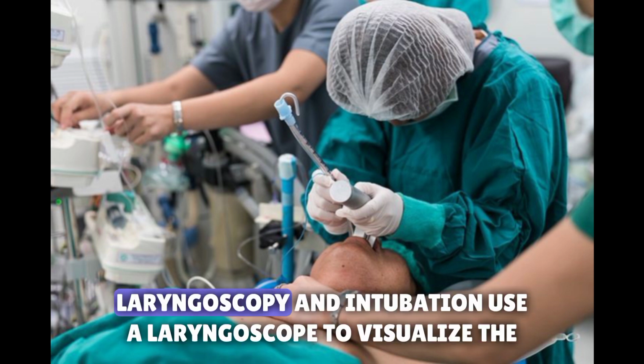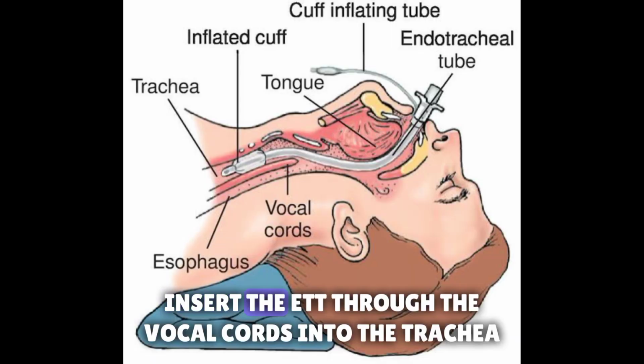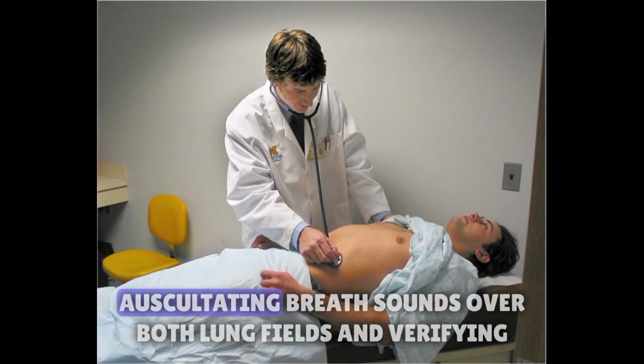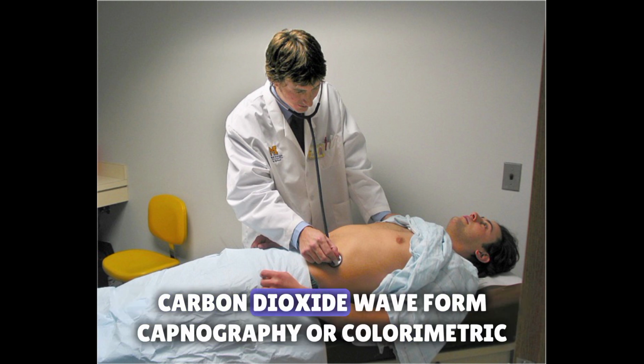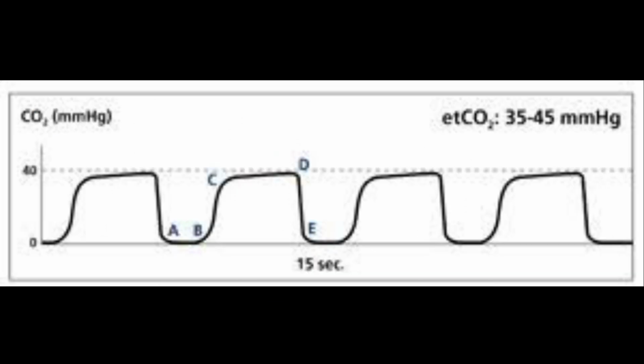3. Laryngoscopy and intubation. Use a laryngoscope to visualize the vocal cords. Insert the ETT through the vocal cords into the trachea. Confirm proper tube placement by observing bilateral chest rise, auscultating breath sounds over both lung fields, and verifying carbon dioxide waveform, capnography, or colorimetric detection.